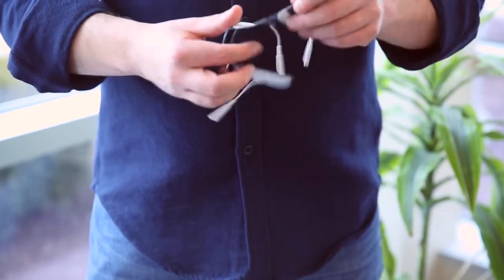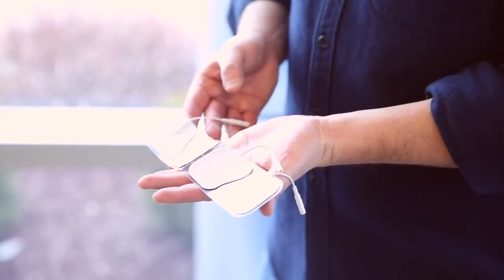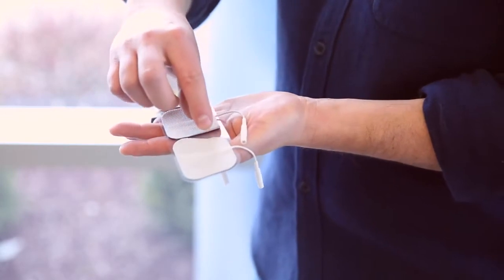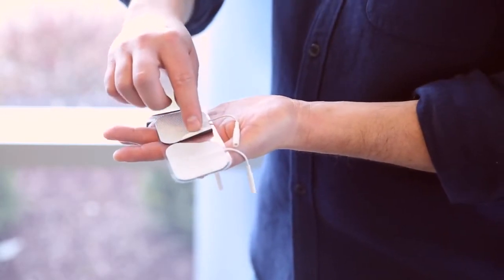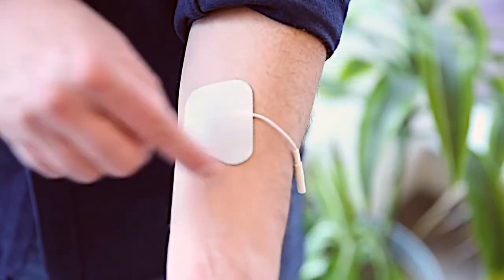Bodymed's new self-adhering electrode with tab makes electrotherapy treatments simpler than ever before. Fabric-backed, this affordable electrode features a new adhesive-free tab that allows you to easily apply and remove the electrode without pulling.